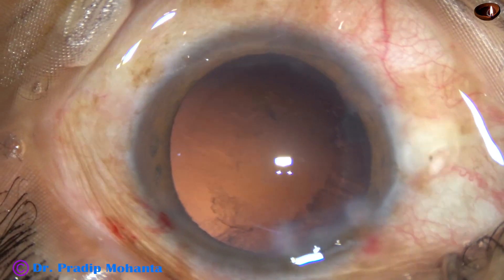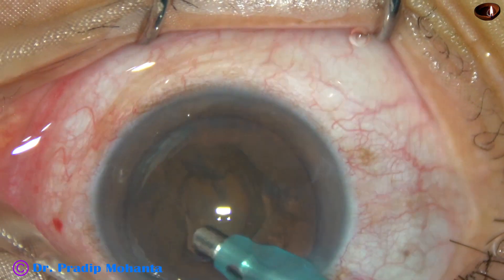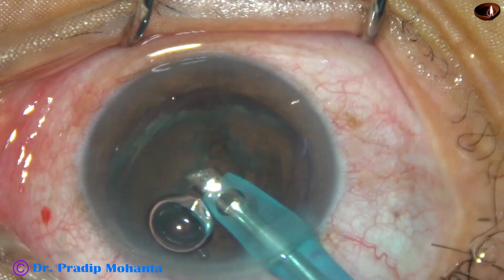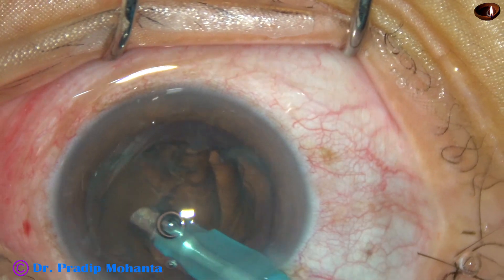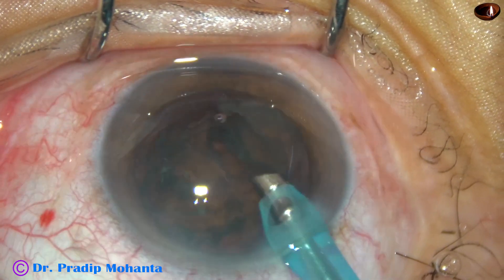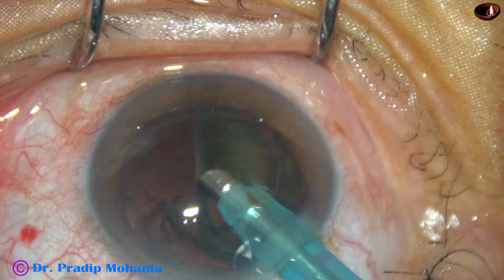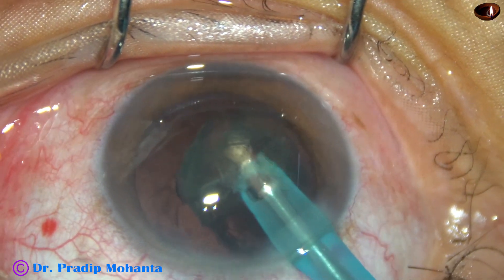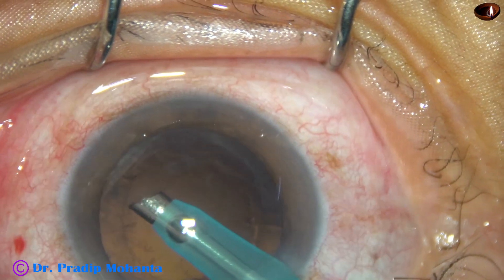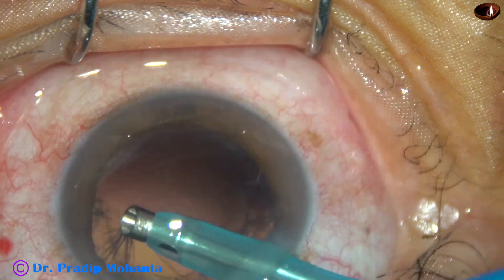So, this is the first case. Now let us see another case. This is the second case. The tip is introduced, bevel down. Vacuum is applied. A little bit of ultrasonic energy is applied — say 20% or 30% energy. The lens tilts. The portion just above the anterior capsule is removed. And now it is held at another place. The whole mass tilts and comes to the tip, and it is emulsified and removed. Now I go to IA mode, and it removes some cortical lens matter.